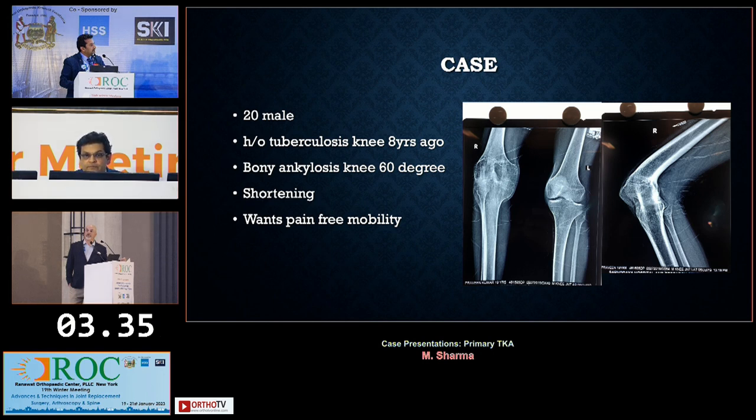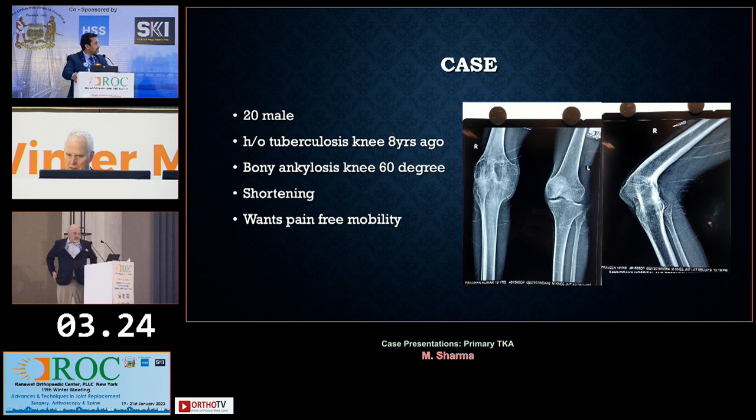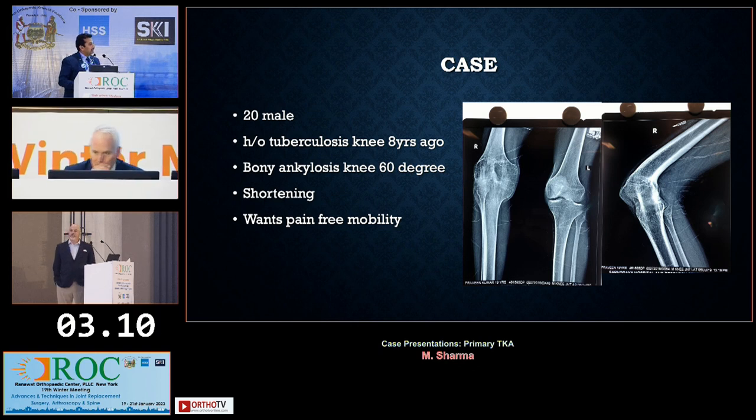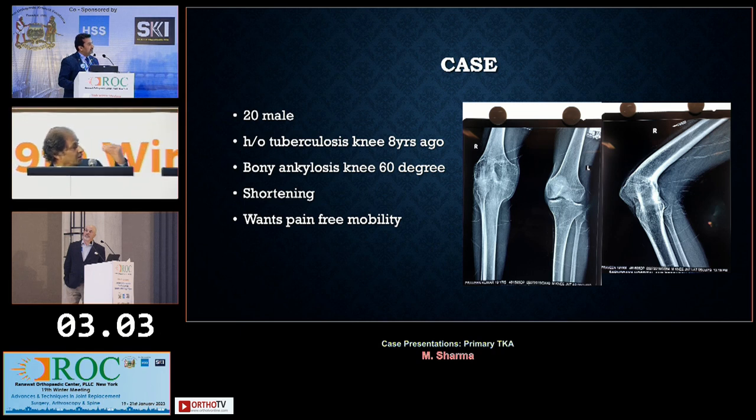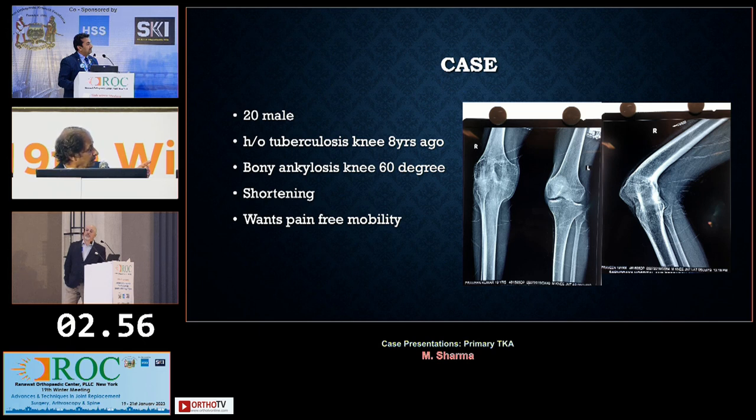Can I ask — what's your trick to figure out the trajectory of your first cut? Are you cueing off the tibia or the femur? Tibia — yes, that's what I thought. You're cueing off the tibia, trying to cut it approximately where it normally would have been. Interestingly, in a lot of these knees, by the time you've done your osteotomy and taken that wafer of bone out from the middle, often in the intercondylar notch you can actually see the posterior cruciate. That tells you that you're at the right level — you take graduated baby steps from there and work your way through.